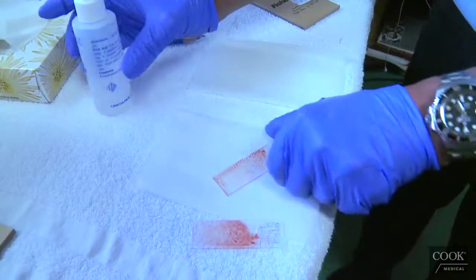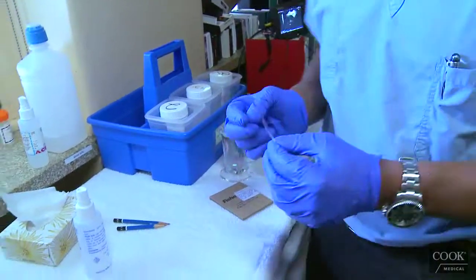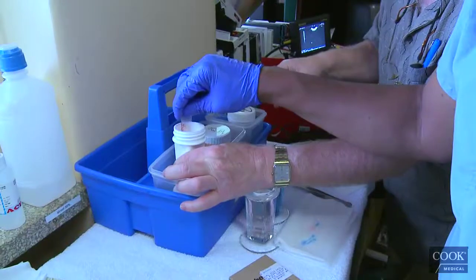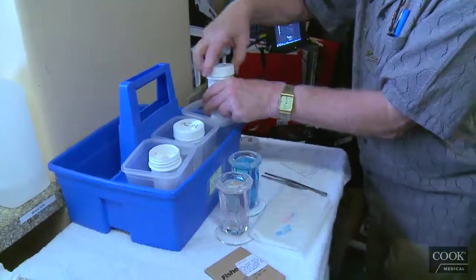So it's very fast. Then I put it in here for him, and then he gets to work on staining them.